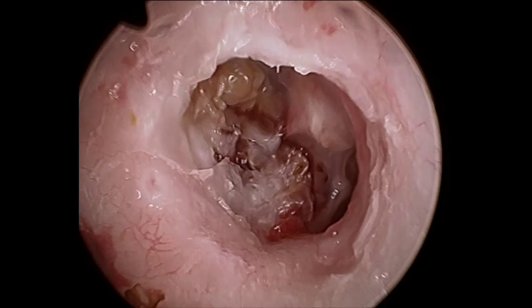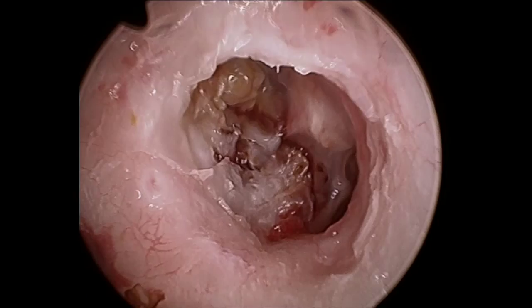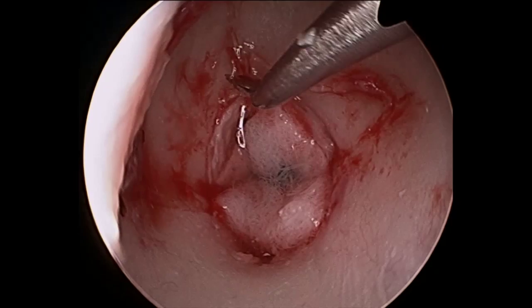The cholesteatoma can be seen extending down towards the intact and normal stapes superstructure and the tendon of the stapes, with an abnormal incus and malleus noted anteriorly.